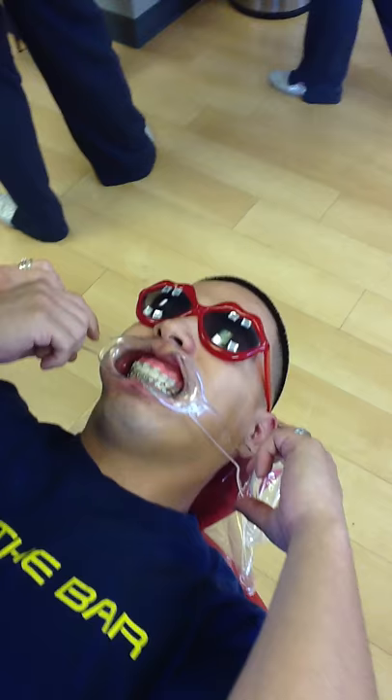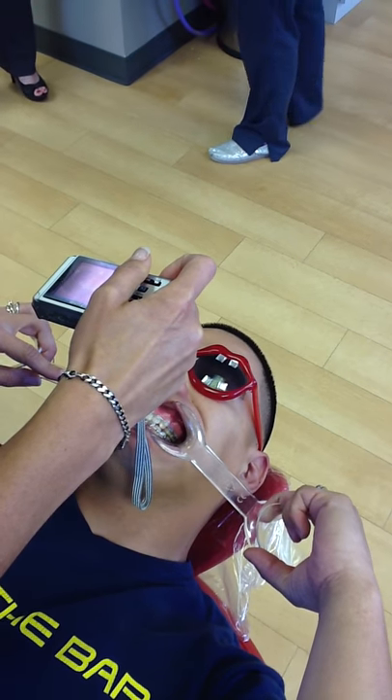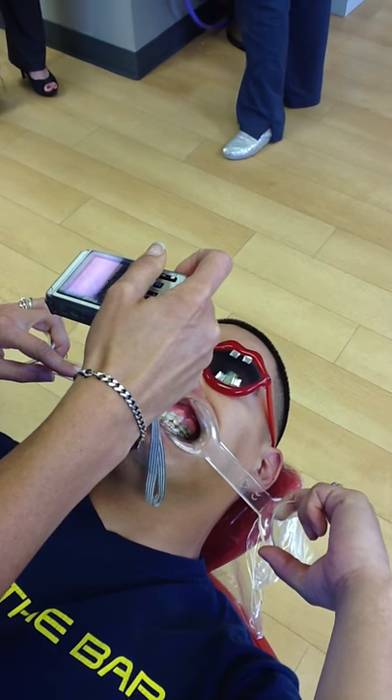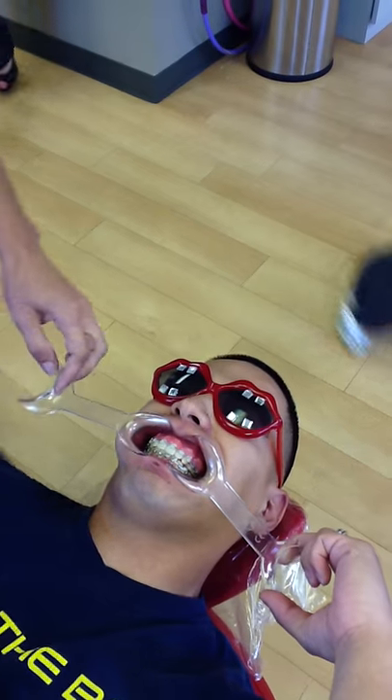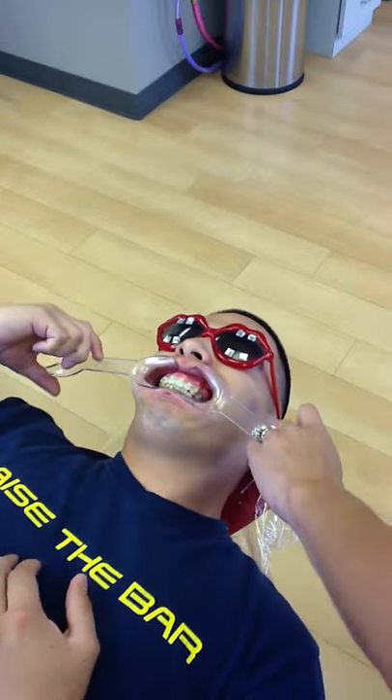Turn and face forward for the center photo — you're going to ask them to stretch it out, and you'll try to get both rollers in frame. Same thing on the right side.